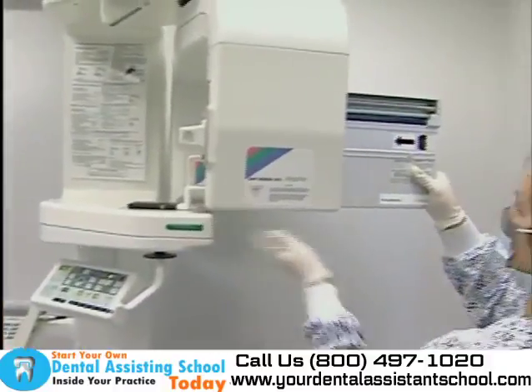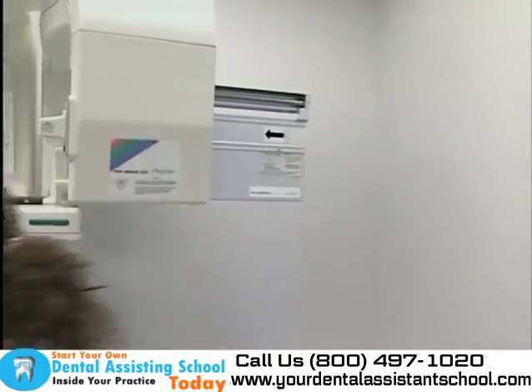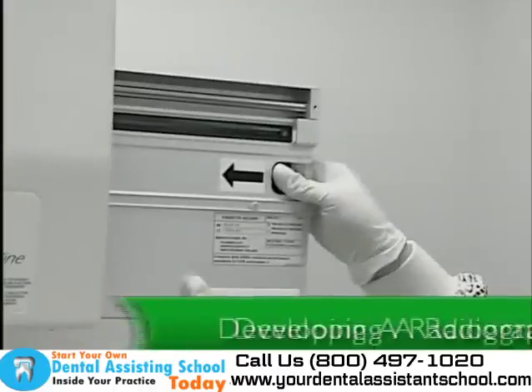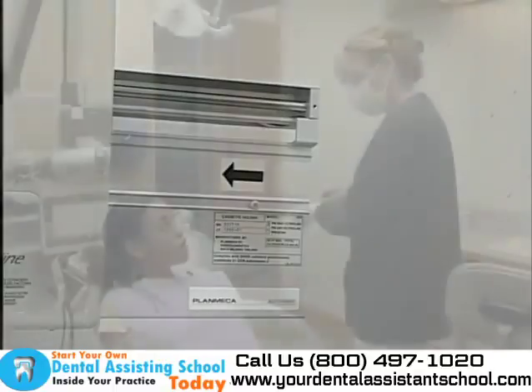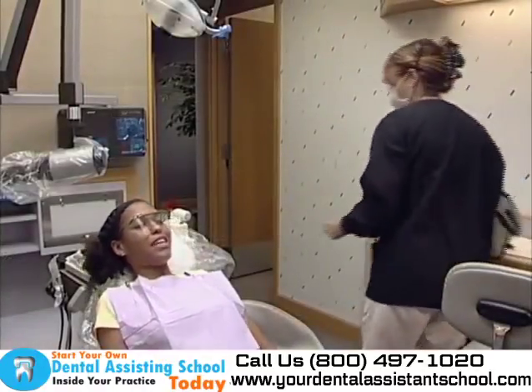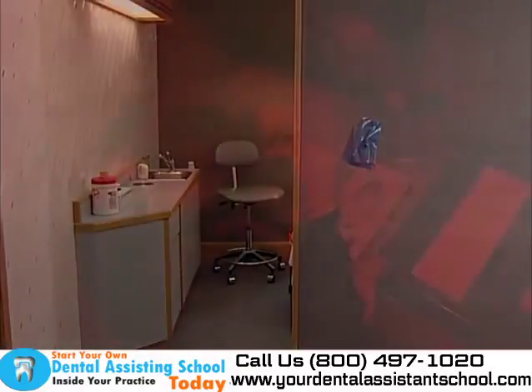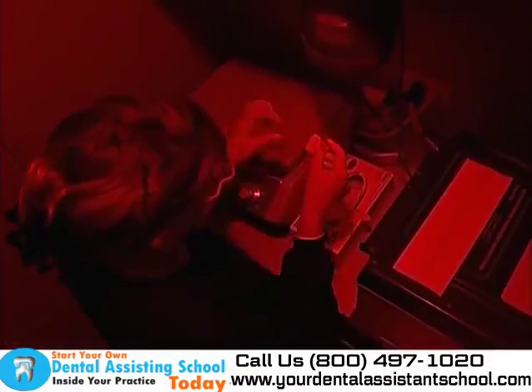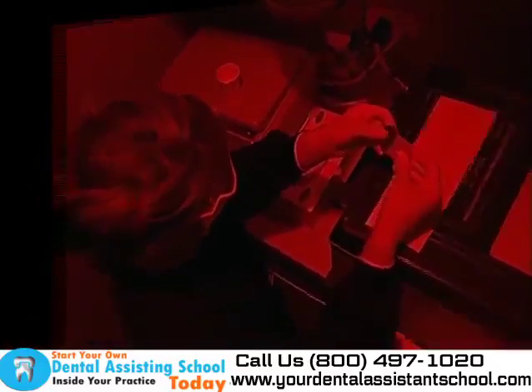The cassette containing the film is removed and taken into the darkroom to be developed. Film can be developed manually or automatically. Generally, the film is developed immediately. The dental assistant may use an automatic developer with a daylight loader or go into a dark room to develop the film, as daylight will expose and ruin the film.